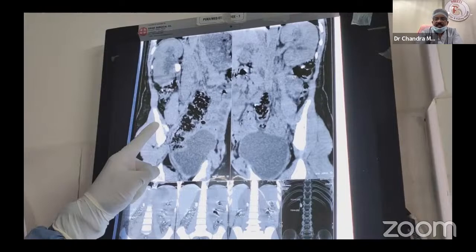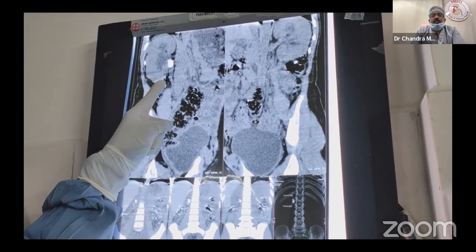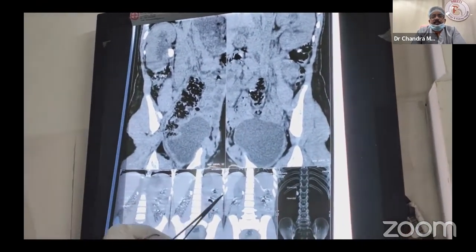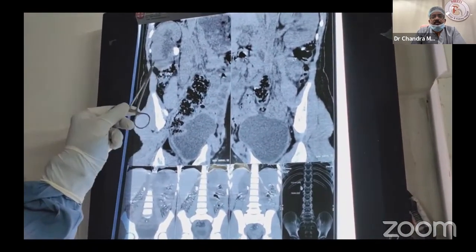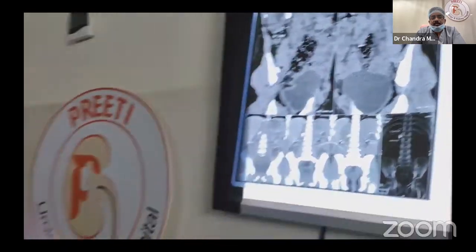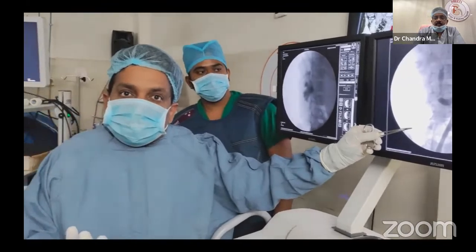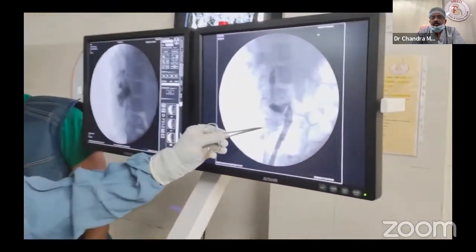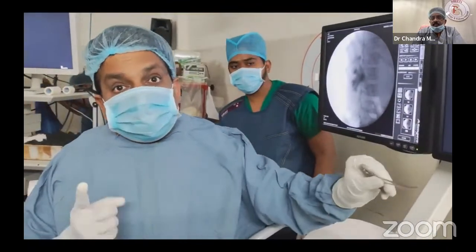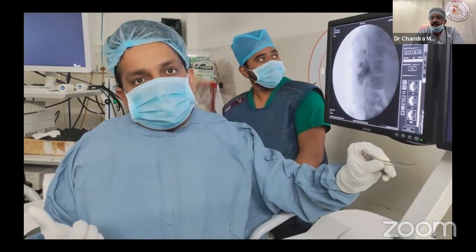Let us see. I will start the video. With the upper ureteric impacted stone, large one here, when you are doing such cases in a meaty kidney, RIRS versus PCNL is the discussion. On that basis, we are going for this surgery. Supine PCNL or prone PCNL is RGP. In supine, in the same position we can do RGP and take a decision. But in prone, whether to inject contrast before positioning or not is the controversy.